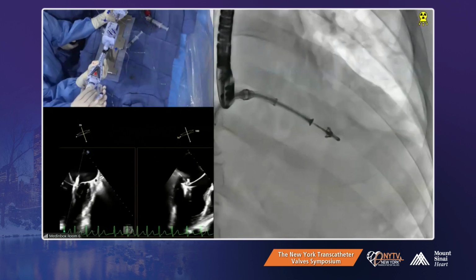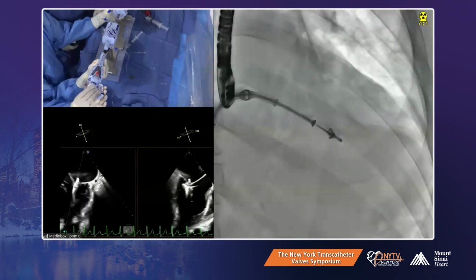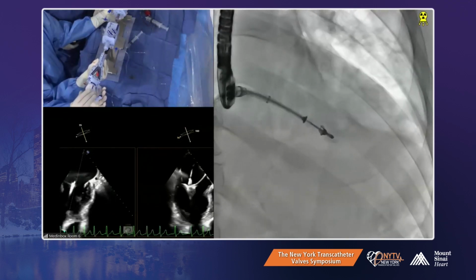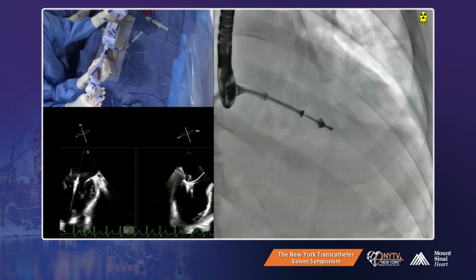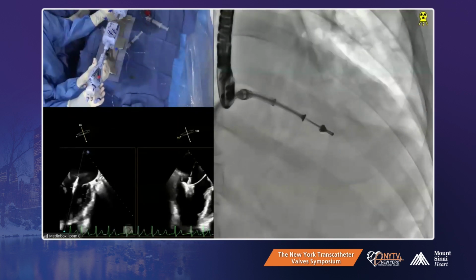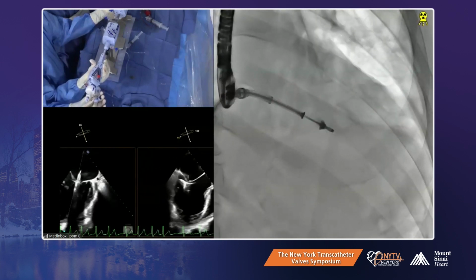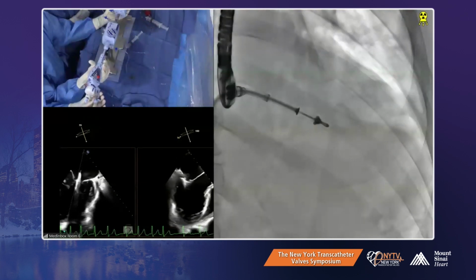But you see the buckling, right? So that's what Howie was talking about earlier. I think it looks better. It looks like it turned a little bit as you pulled up. I would try to clock your guide a little bit. I think anterior looks really good. I would take anterior, I would clock a little bit and take posterior. Anterior is good. Take it.